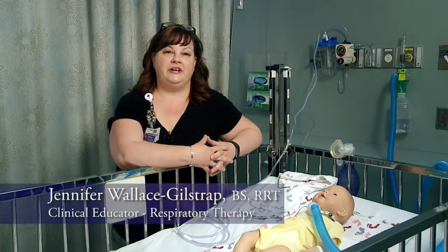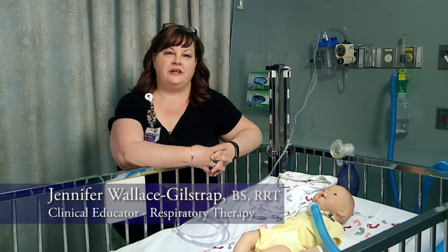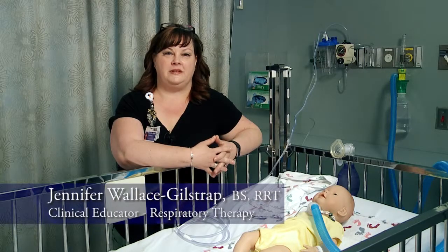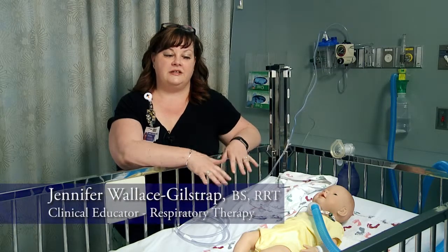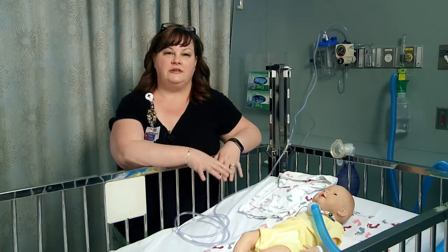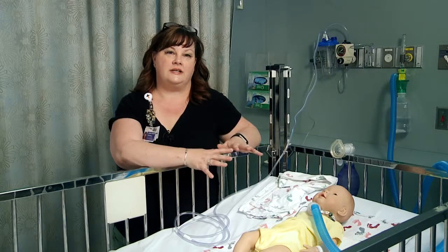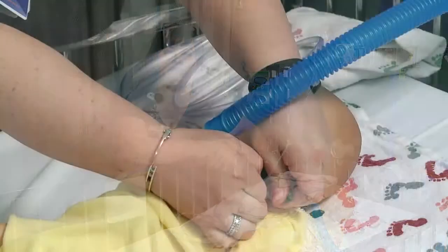Today we're here to demonstrate pediatric tracheostomy management. The skills we will show you today you can use either at home or in the hospital setting.